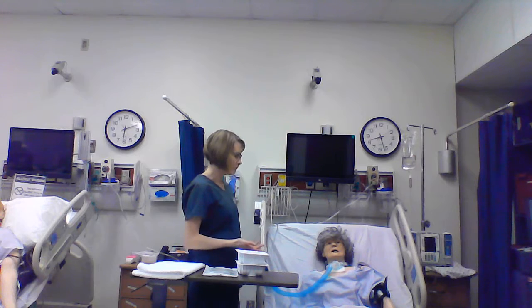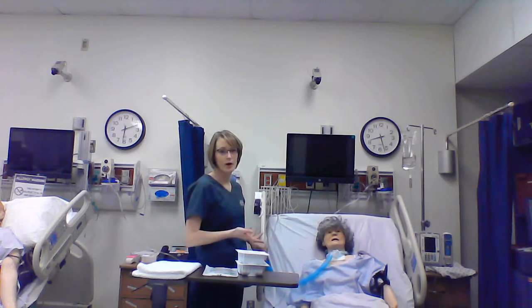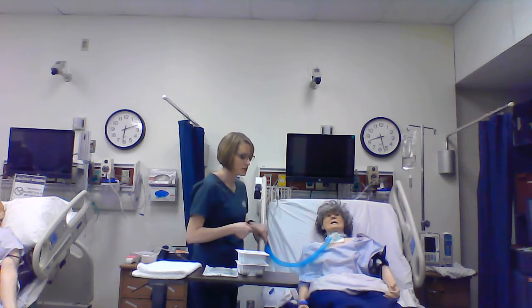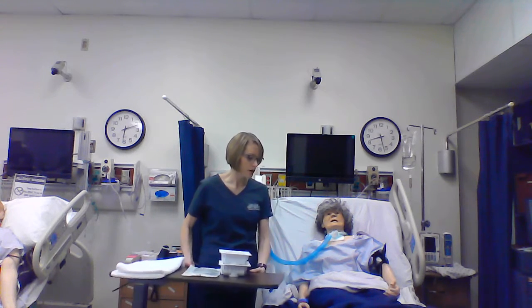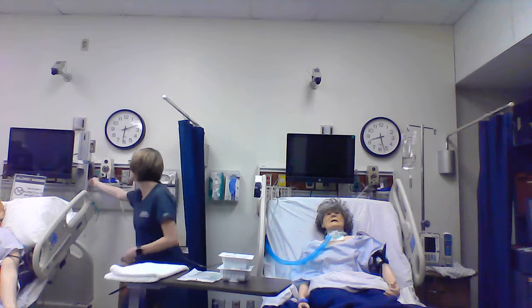So this is Opal. I'm going to raise Opal to a working height and describe to her a little bit about what we're going to be doing. Especially if this is a new trach patient, this can be uncomfortable and scary for them. So I would explain to Opal what we do with suctioning and trach care. I want to make sure and hyperoxygenate her, so I would turn her oxygen up.